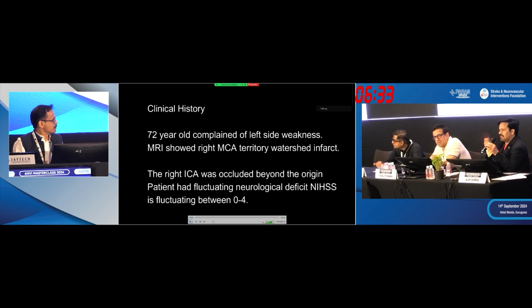It was just inside. So you have to take care that the implant stays inside the catheter. You are just supporting it from inside. The implant tip should not come out because it will perforate, it will dissect further. This is something I wanted to add for the residents.